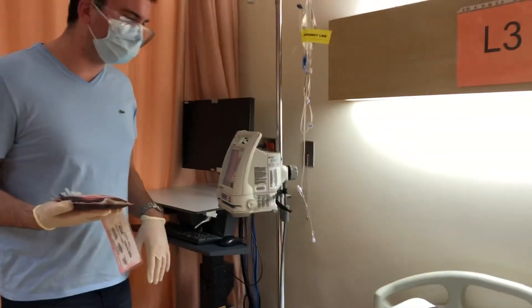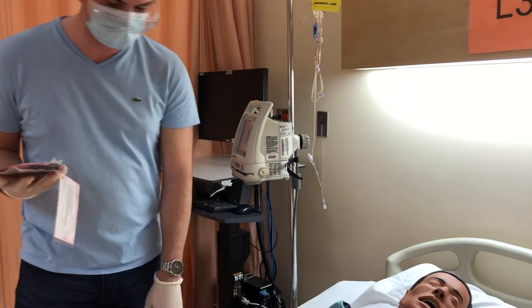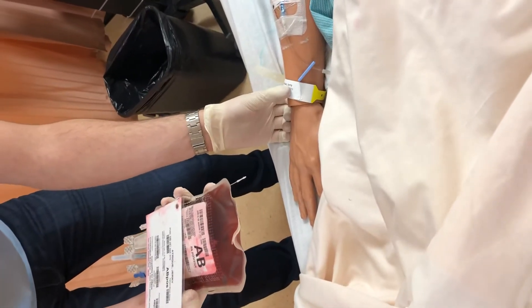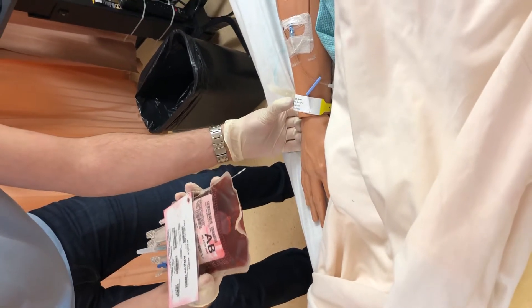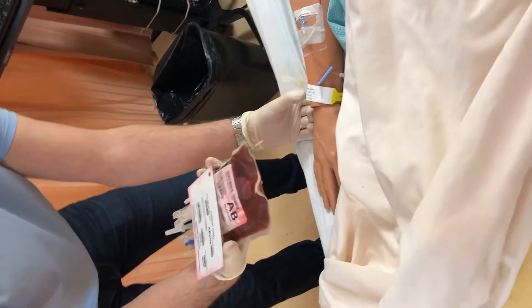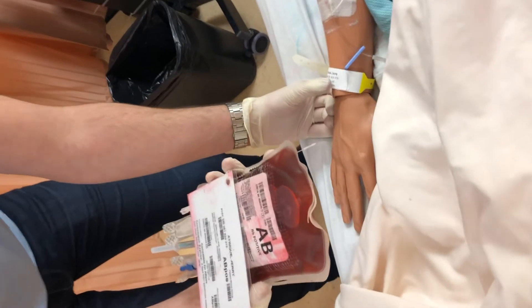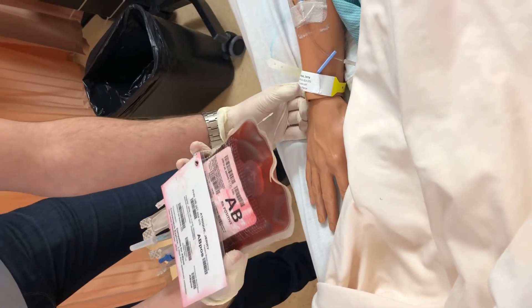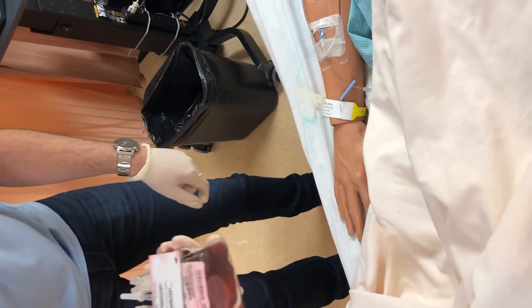I introduce myself: Hi, I'm Zach, I'm going to be your student nurse today. For my fourth check, I need to compare the blood tag to the patient's arm band. We verify: Jerry — J-E-R-R-Y — Atrique — A-T-R-I-Q-U-E — FIN 261-824-375, and I ask the patient to confirm their birthday. It matches the arm band. I also ask about allergies — the patient reports none.